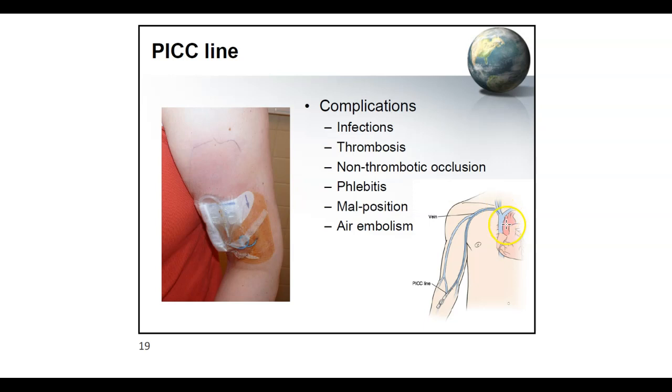And so there are times that if you have a patient who has a PICC line, and let's say everything else is normal, their electrolytes are normal, but then they're having a lot of PVCs, or basically ectopic abnormal heartbeat, and it wasn't there before, you may want to assess your PICC line, because sometimes just the movement of the PICC line from one area, and maybe it's too close to the atria, it can actually irritate the heart, and it can cause some dysrhythmia. So anyway, malpositioning can cause other things.